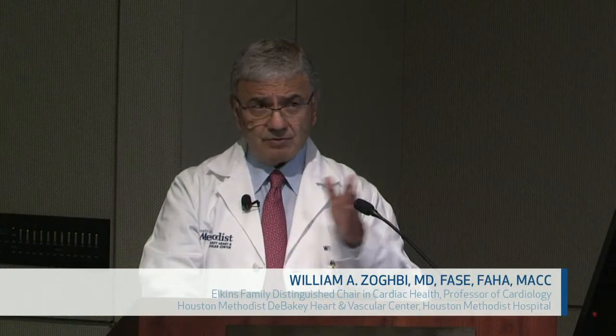We still have those, but we ask a different question: what happened to the frequency of what we sent? And this is Doppler, right? So we have two principles, basically. One is depth and structure and actual imaging, and the other is flow, which among all your other imaging technologies is the best to tell us about flow, velocity, and actual velocity from beat to beat. And hopefully you have a wonderful year.